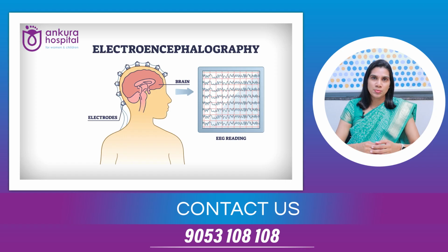Here what we have to remember is the EEG will record only the electrical activity which is present at that point. So it's real time monitoring. So if there was a seizure a couple of hours ago, it will not record the seizure, but whatever is there, it is recorded. Then you might have a question: why is it done if it is not recording the seizure?